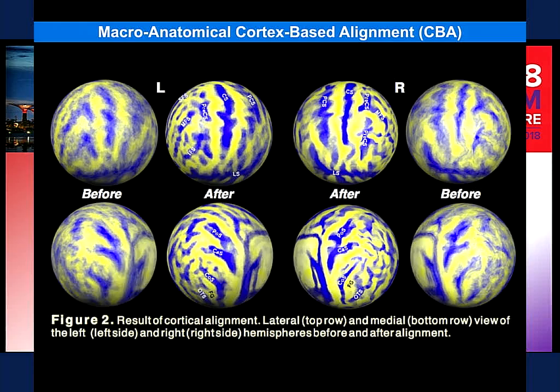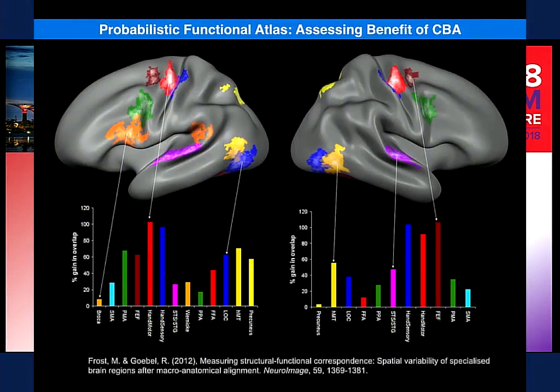You see this from this to this, or for the other hemisphere from here to here, right and left hemisphere. That shows that we can identify landmarks much better, and we can project the resulting alignment back into 3D and have each brain's sulci and gyri also three-dimensionally corresponding with each other.